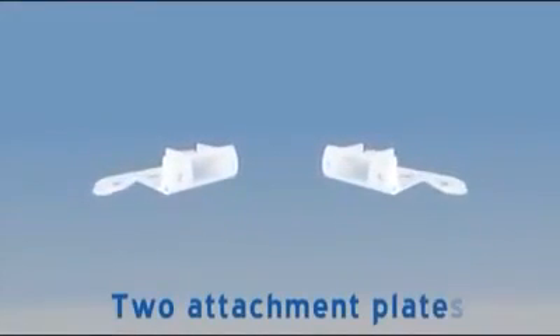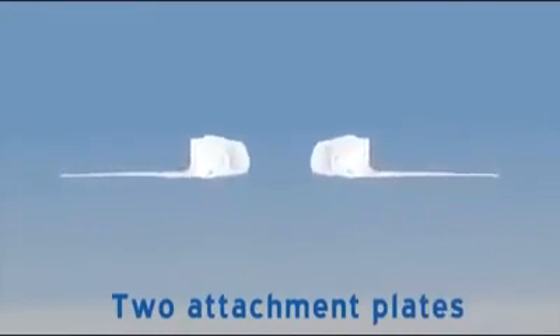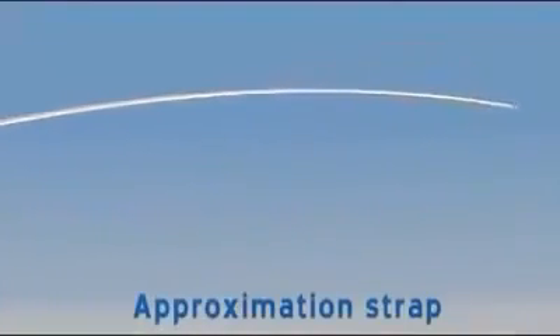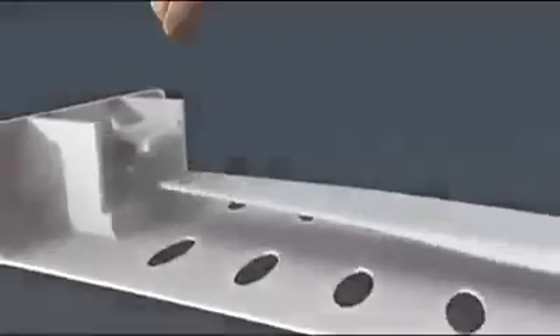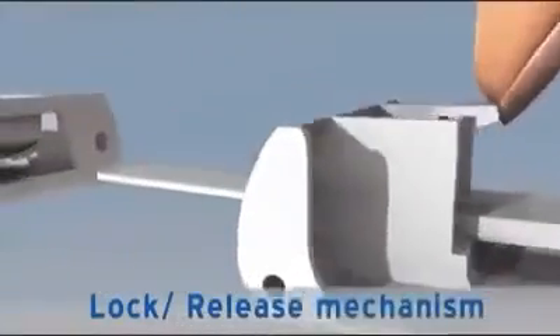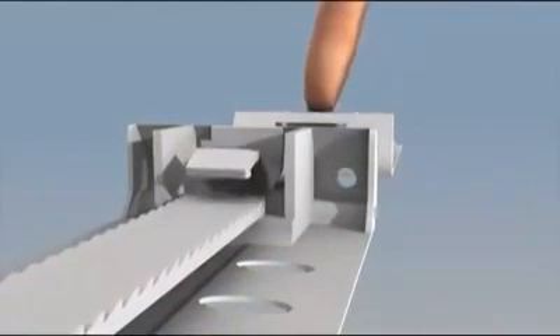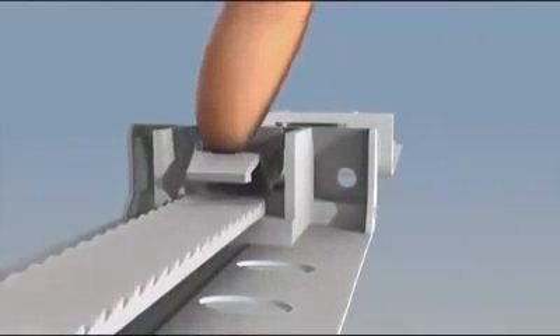The system comprises two attachment plates with adhesive tape attached to their underside and an approximation strap. The strap is inserted into one plate's lock-release mechanism and then to the remote plate. The mechanism should be pressed in order to lock the strap to the plate.